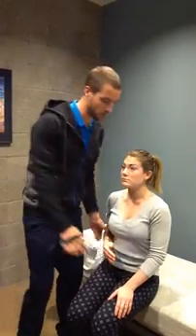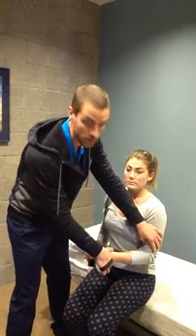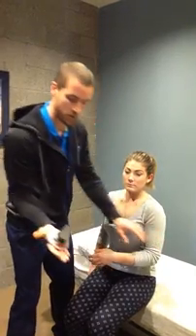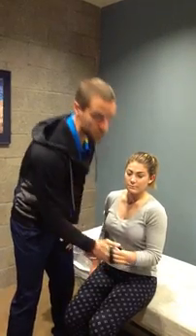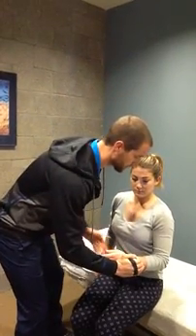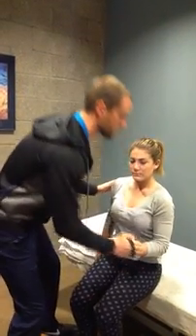And then from there, Sarah will do this arm, you're going to have the arm at sideline. You want slight internal rotation, about 10 degrees, so the muscle's at mid-range, a little bit of slack. You're going to put the dynamometer right onto the wrist, and that is your pressure point, and this is a break test, meaning you're going to resist them until they basically can't do it and the motion breaks. You're going to do at least 2 trials, take an average of those 2 trials. So for her, I'm going to have her hold here, elbow on her side, and I'm going to say, don't let me move you, hold, hold, hold, hold, hold, good. So that's infra and teres.